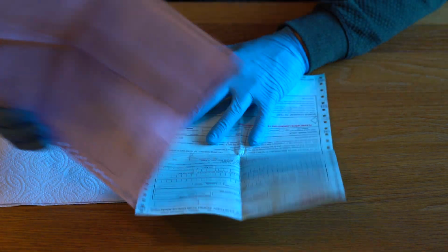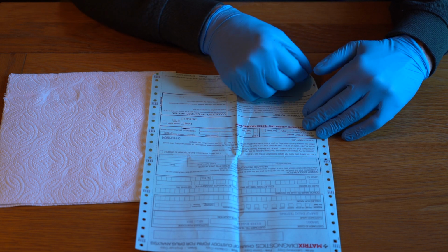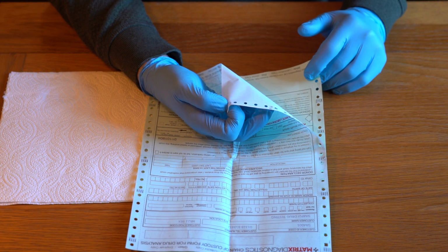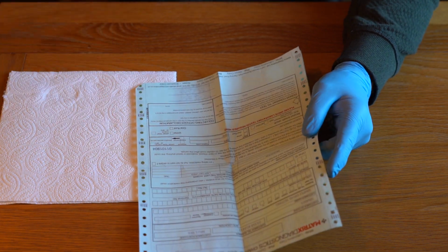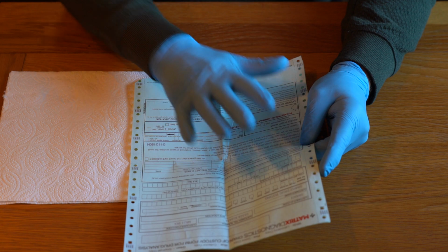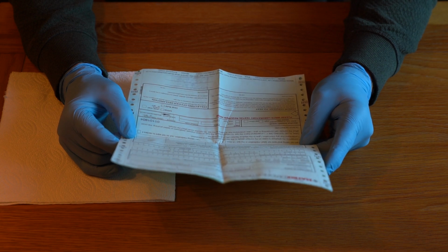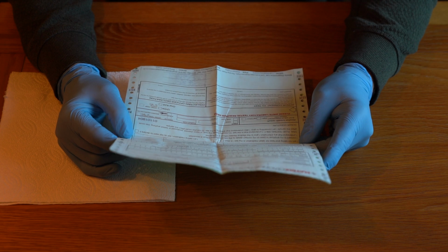So you give them the pink copy, the blue copy and the green copy. The blue copy is the collector's copy and the green copy is the employer's copy. I don't see any reason why you'd want to separate these, and what I do is I staple the initial test consent form, the one that we completed when we did our first line indicative test, to these and I send that off to the HR department, and that is how to conduct a second line oral fluid chain of custody test and send it off to the Matrix Diagnostics Laboratory.